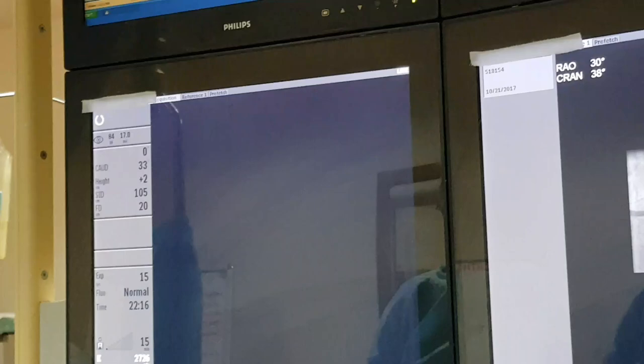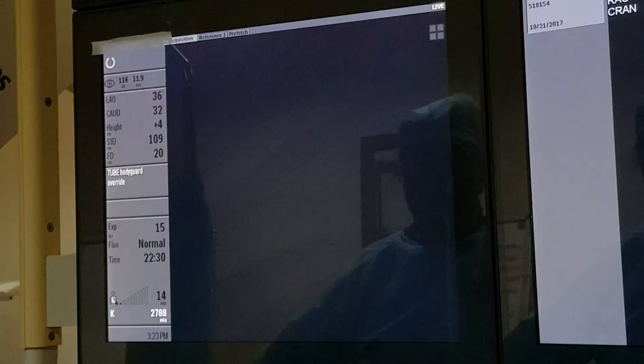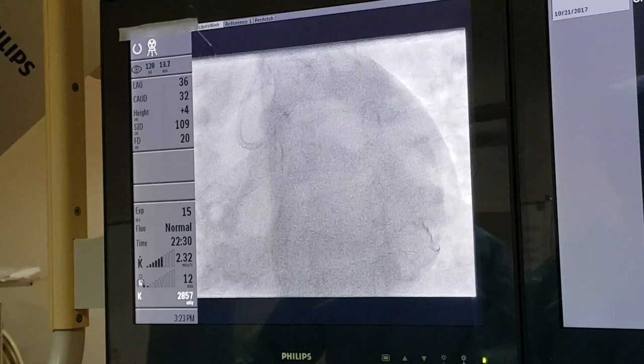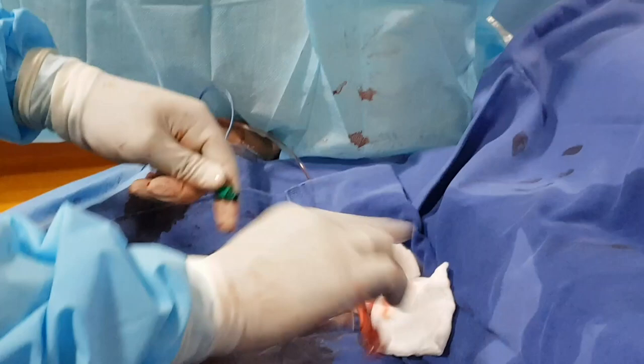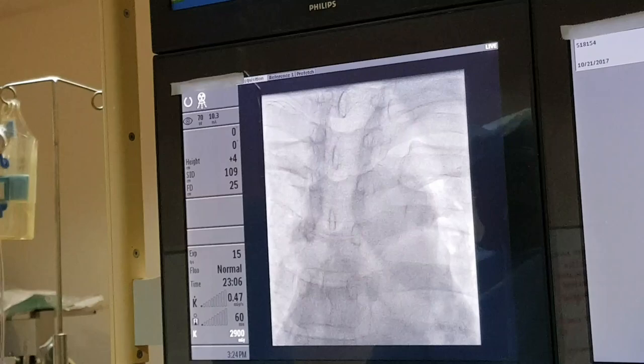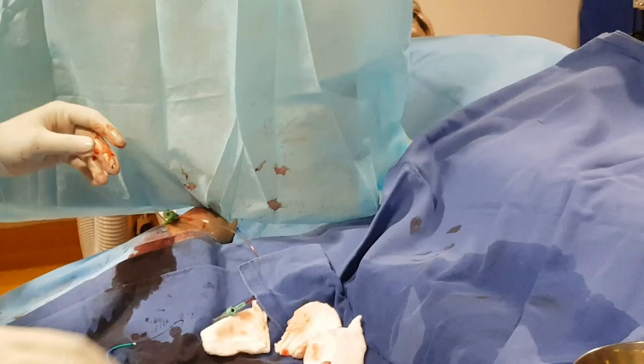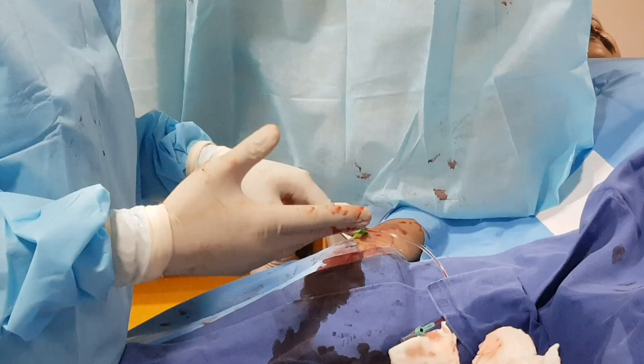The angioplasty is over. I am removing the guiding catheter from the coronary artery and then the manifold. Sister will pass me the wire, and I will advance it into the guiding catheter under fluoro. The wire exits the guiding catheter, then I remove the entire unit from the coronary artery and radial artery — that is it. The sheaths will be removed later, maybe after two to three hours, once we check the clotting time called ACT; once it is less than 150 we will remove the sheath.